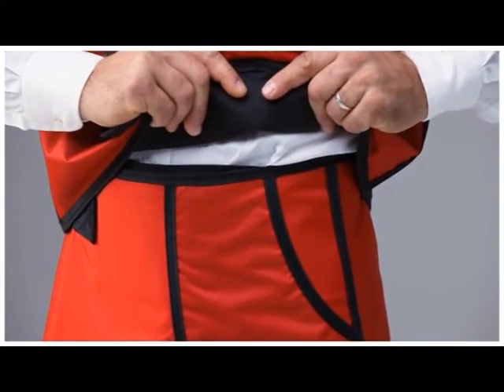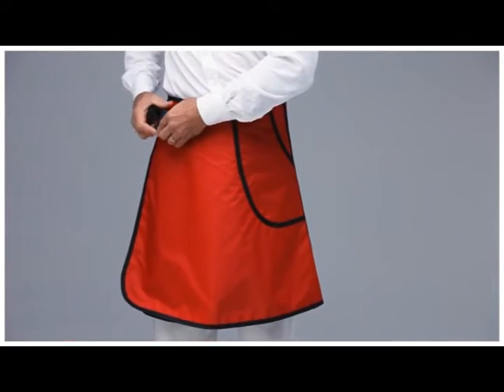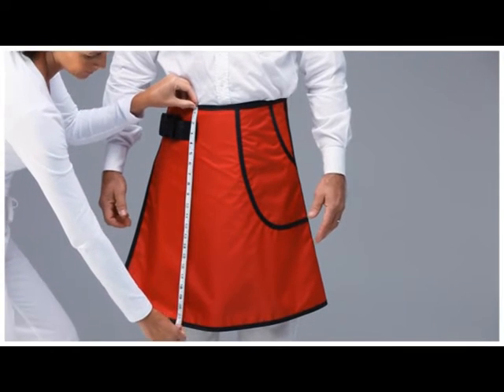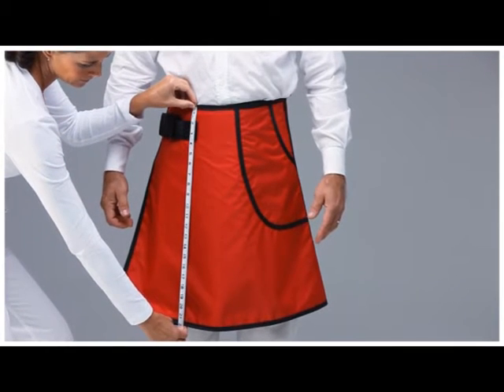The length of the skirt is critical for proper bone marrow protection. Measure from the top of the skirt to just above the knee. Record the measurement, making note of whether you use inches or centimeters.